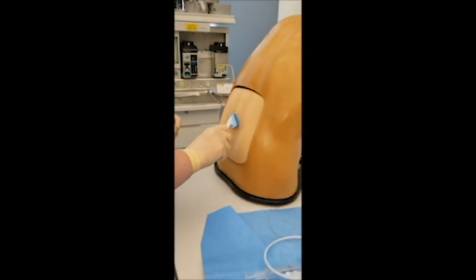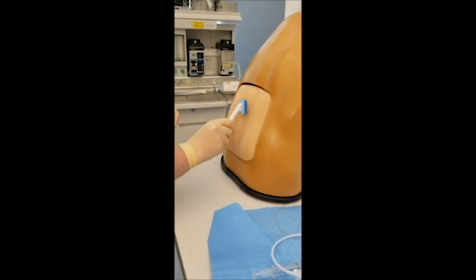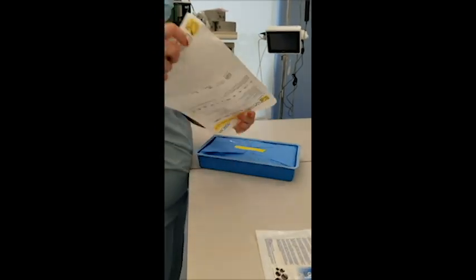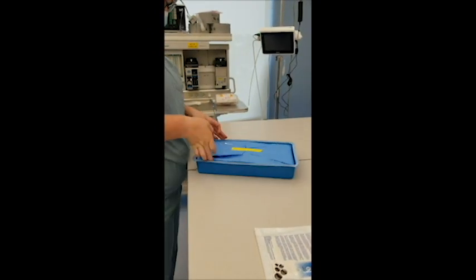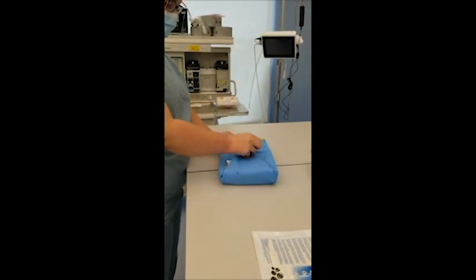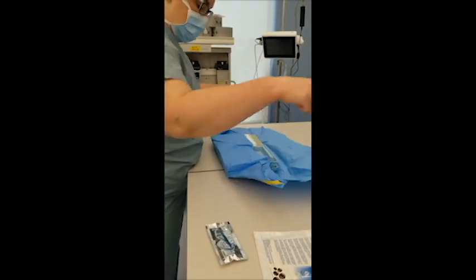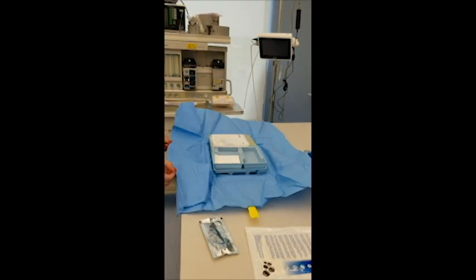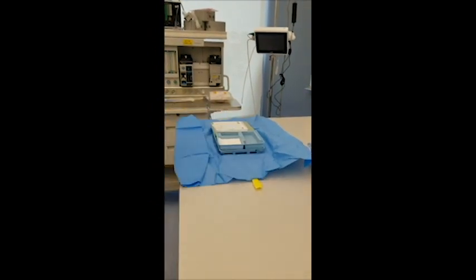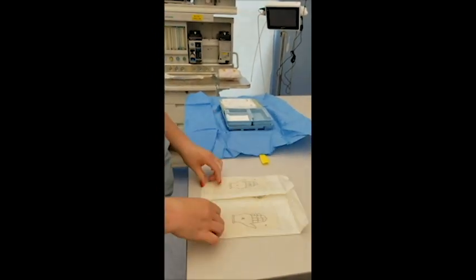Before opening sterile gloves, clean patient's back with a chlorhexidine solution or betadine. Open kit in a sterile fashion as shown. Once kit is open, apply sterile gloves in a sterile fashion.